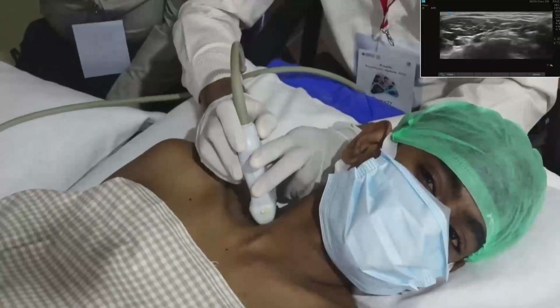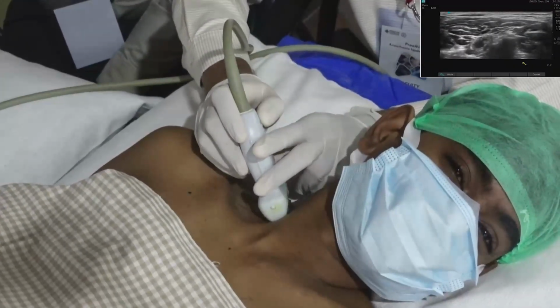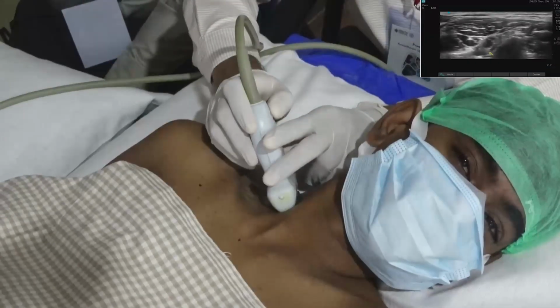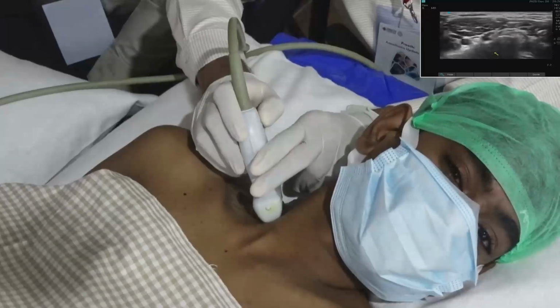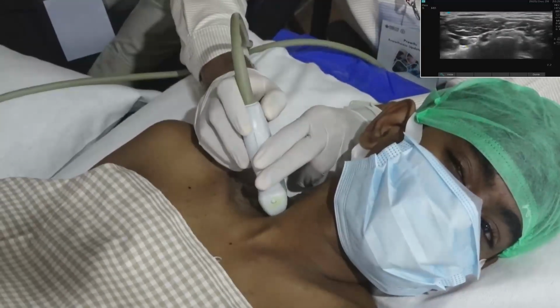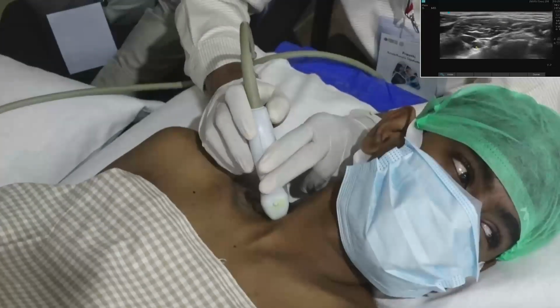The transverse process of C7 has a posterior tubercle, while the anterior tubercle is very much rudimentary or absent. In that place you see vertebral vessels.